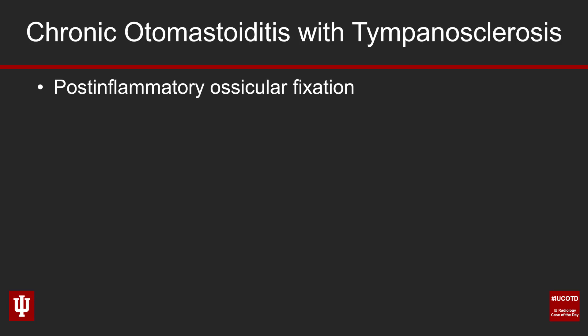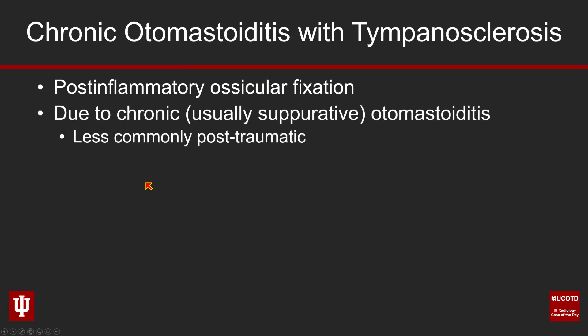This patient has chronic otomastoiditis with tympanosclerosis on the right. What is tympanosclerosis? I tend to lump all the imaging manifestations under the broad category of post-inflammatory ossicular fixation. This is due to chronic — usually suppurative — otomastoiditis that repeatedly affects the ear: it gets inflamed, it quiets down, it gets inflamed again, in a repetitive process. Less commonly, you can also see this in the setting of trauma, but much less commonly — trauma can be a setup for developing tympanosclerosis.